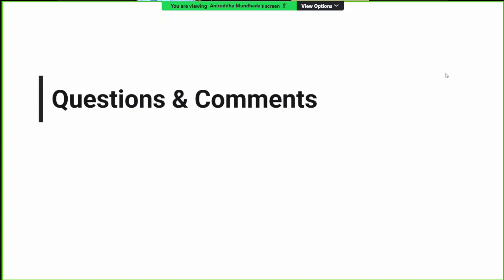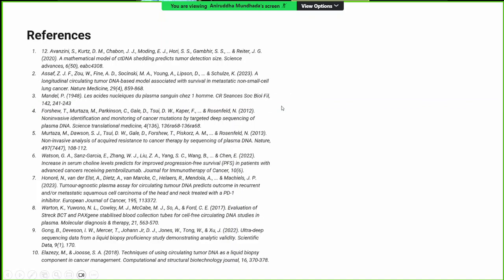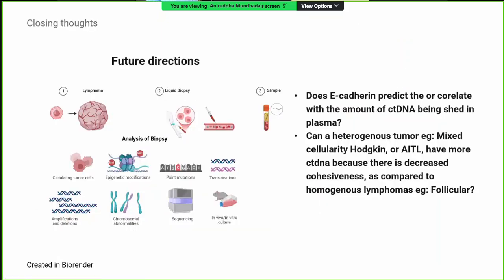First, it can be used for screening, like cancer screening. There are some publications about that. They even claim that they might be able to screen for 42 different cancers. The second application is for diagnosis, to confirm the diagnosis. And the third application is for treatment.